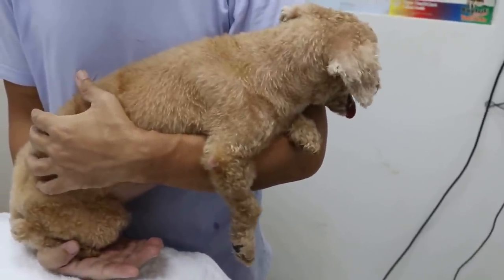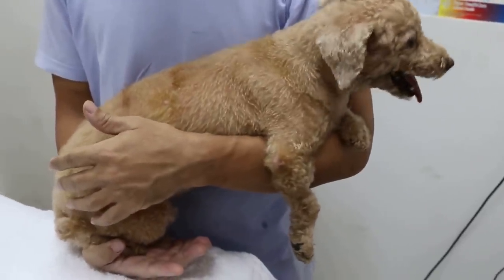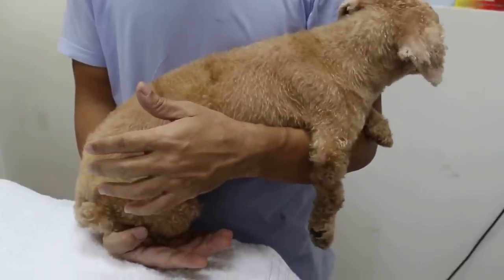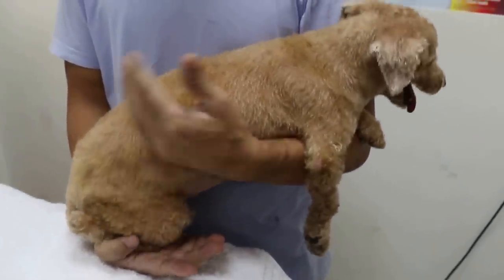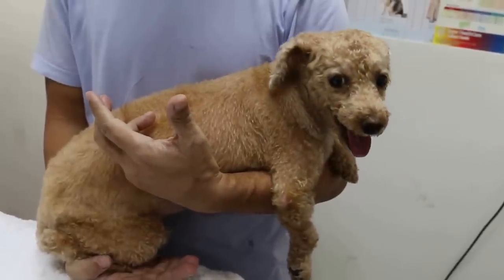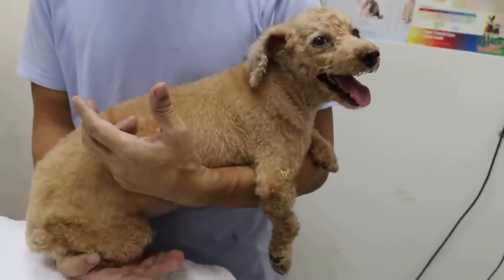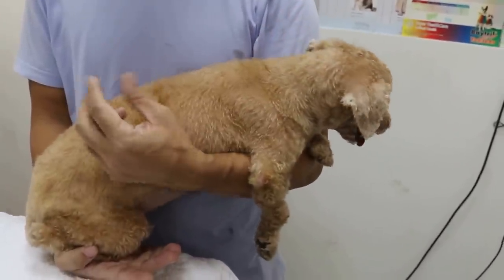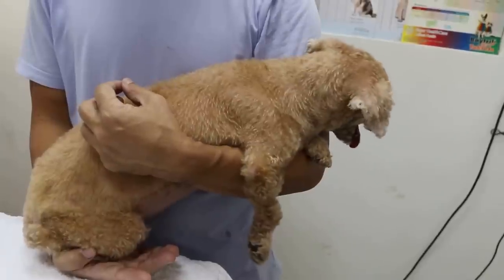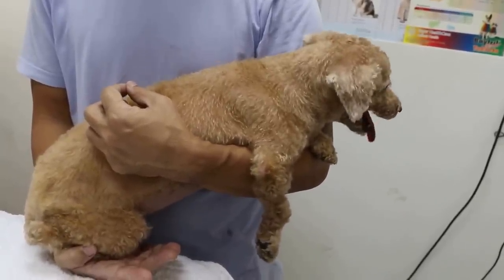What causes it? Maybe you can explain. Later I explain to you. So the main thing is that there's no fatty liver? It could be due to steroid hepatopathy. He's worrying about tumours only. Liver tumours less likely, but possible adrenal gland. No tumours around the lump on the liver? Nodules in the liver, no tumours in the liver. Because on x-ray you can see only an enlarged liver. But spleen's okay? Okay, yeah.